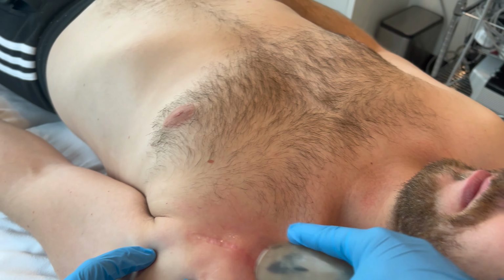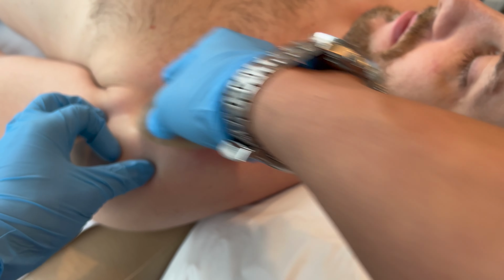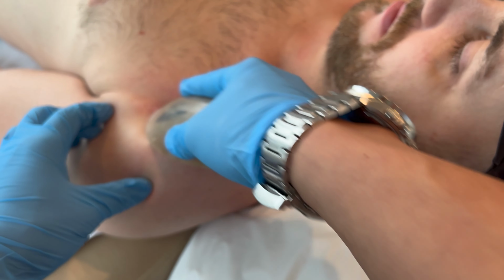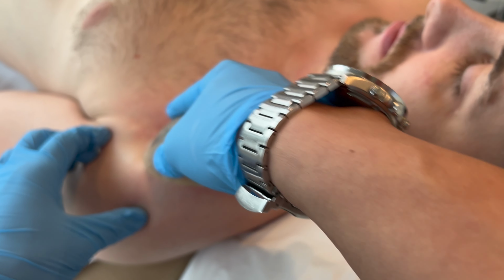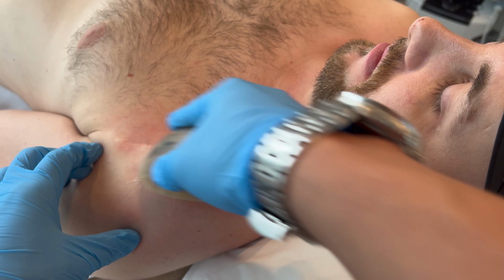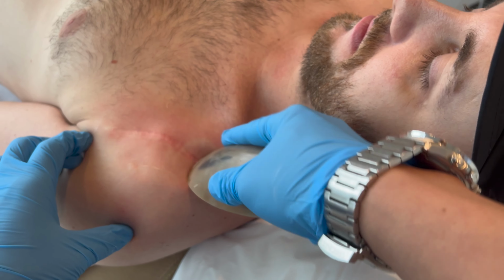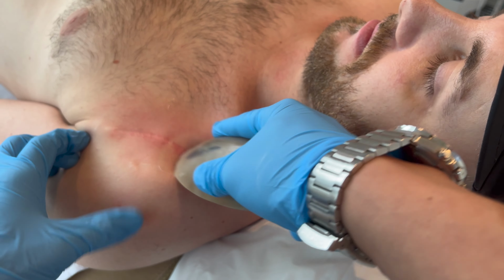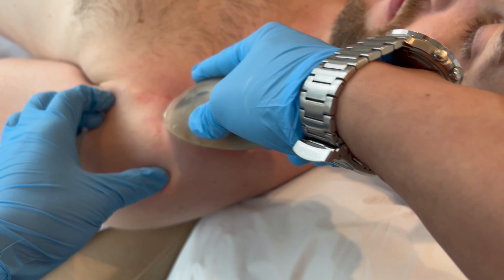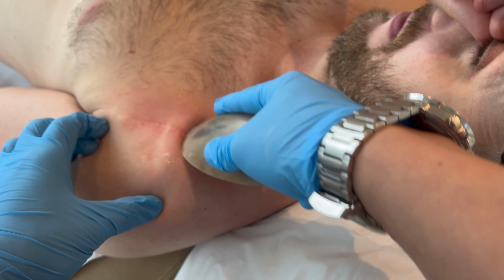So just like that, just go along with the scar and make sure that the scraping instrument is fully in contact with the top of the scar, also paying attention to details, particularly granularity, to see if there are any granular changes along the scar.